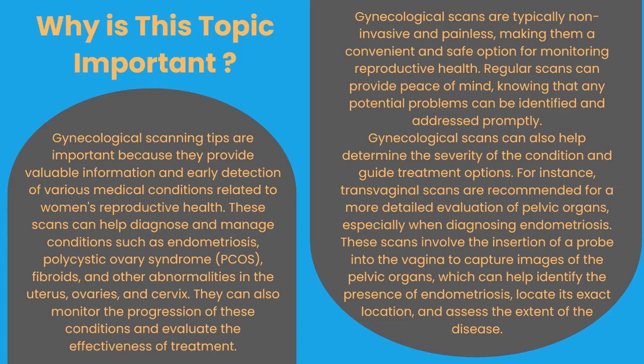Gynecological scans are typically non-invasive and painless, making them a convenient and safe option for monitoring reproductive health. Regular scans can provide peace of mind, knowing that any potential problems can be identified and addressed promptly. Gynecological scans can also help determine the severity of the condition and guide treatment plans.